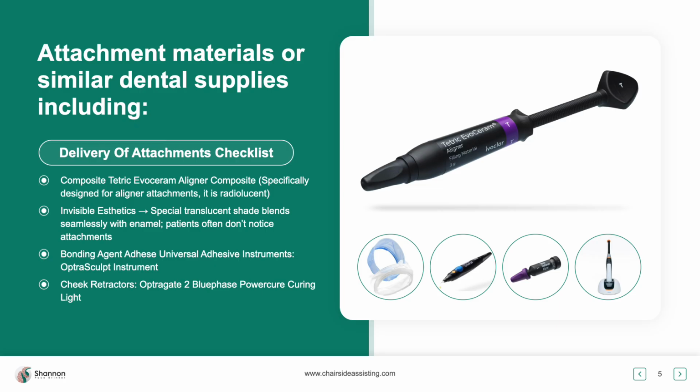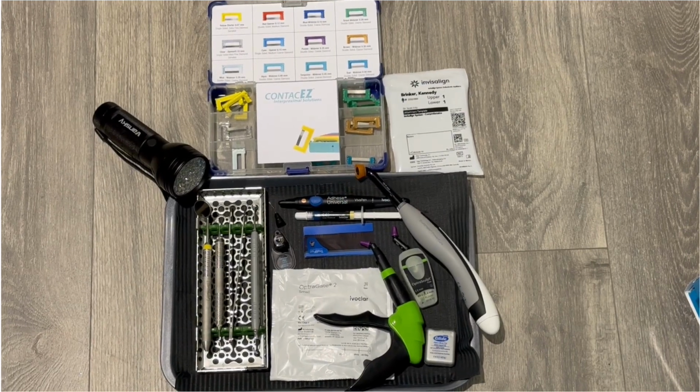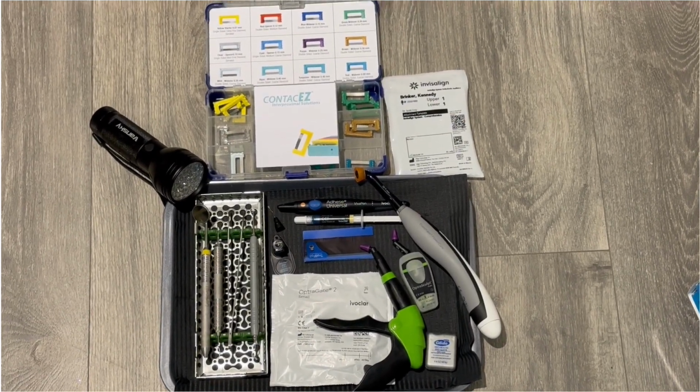We're also going to talk about isolation. We're going to get into adhesives and utilizing a really good curing light. That is the most important part, and that's part of a learn that's separate from this one, is making sure that we're utilizing really good curing lights, because the last thing you want to do is undercure these composites. And if you're utilizing a really good curing light, we won't have to worry about that, right? Now, in my next slide, this is a video taking you through all the materials that we're utilizing here.